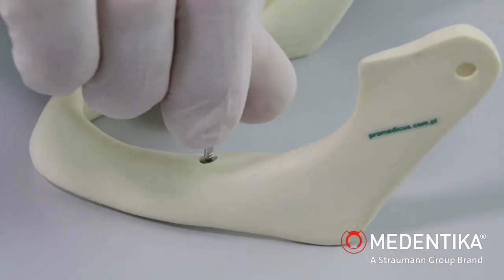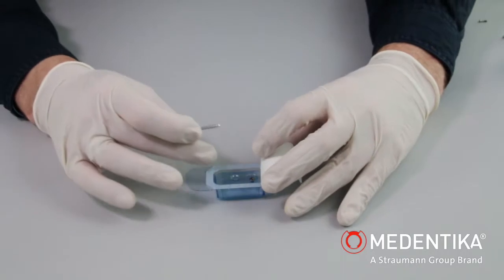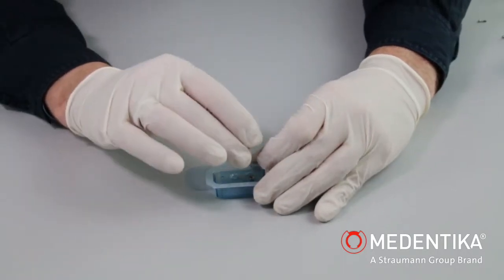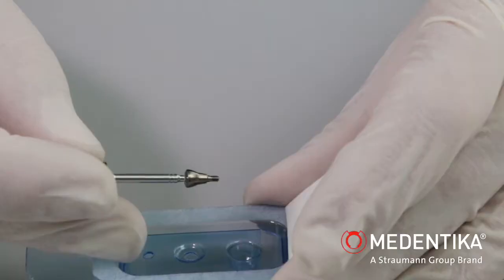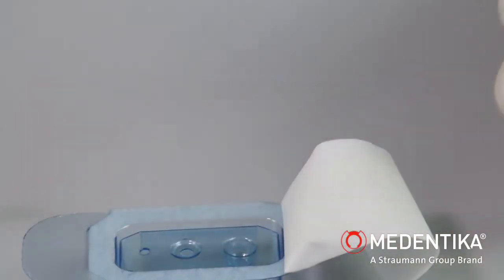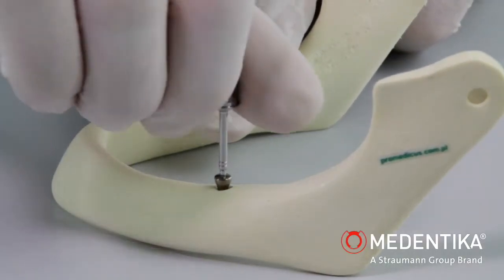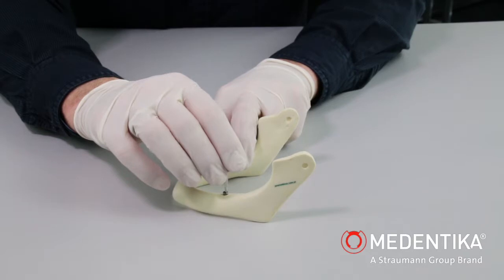If the implant is intended for transgingival healing, a gingiva former corresponding to the thickness of the soft tissue must be fitted after removal of the placement instrument. The gingiva former is removed directly from the sterile blister pack in the same way as the closure screw. The diameter of the gingiva former must be selected according to prosthetic requirements.